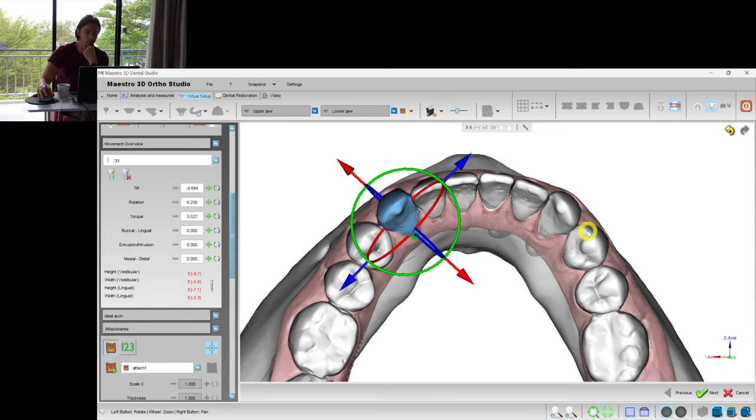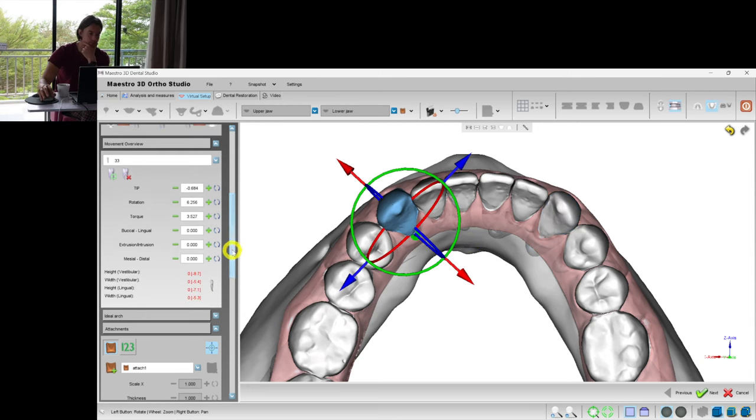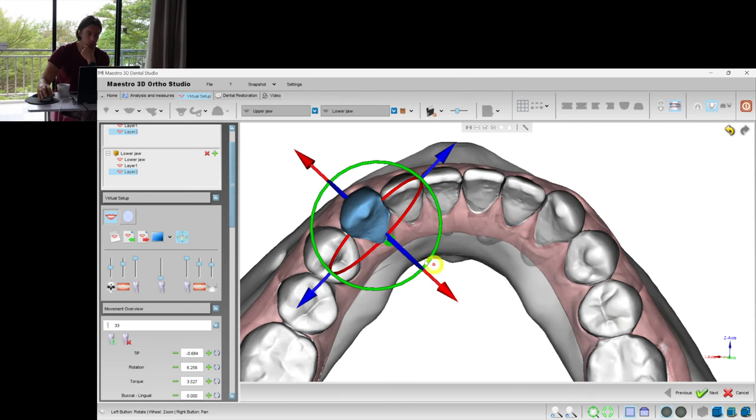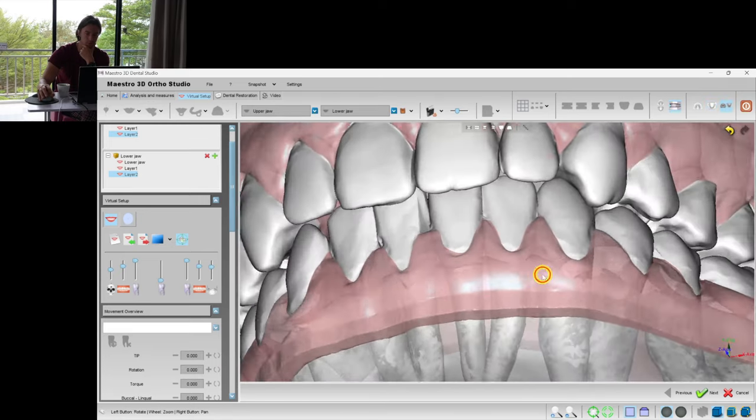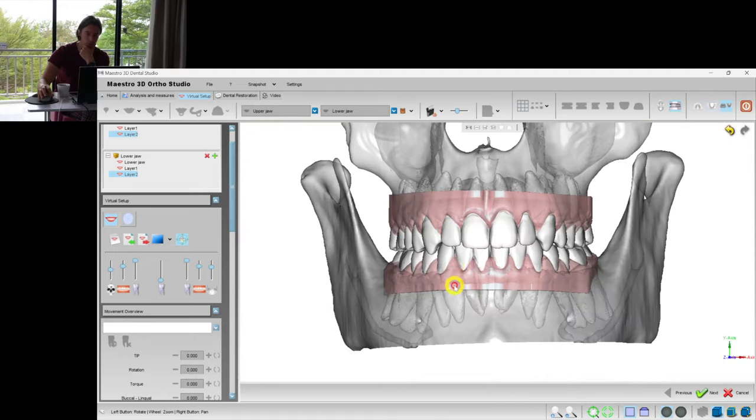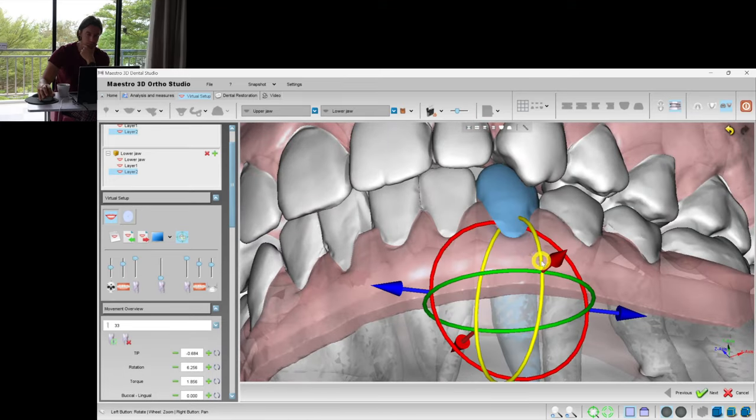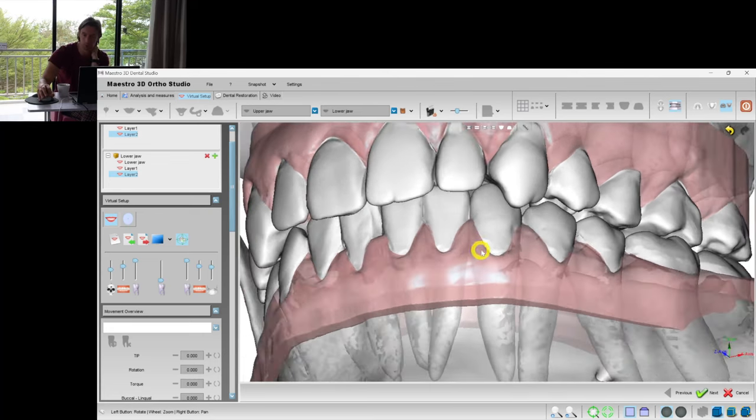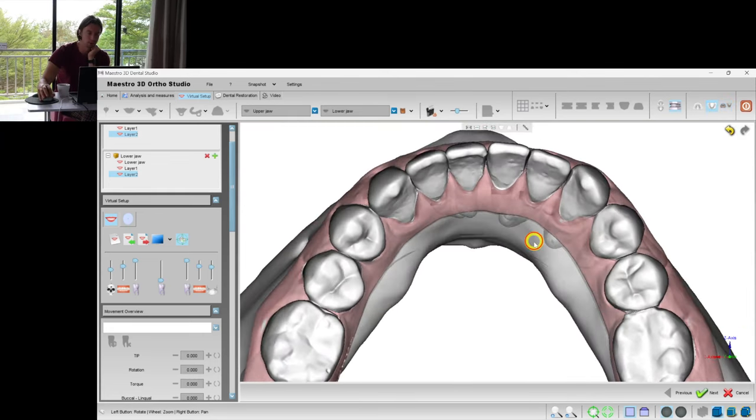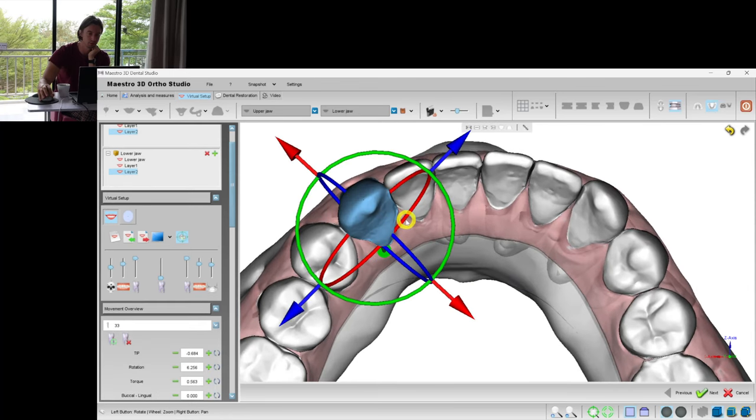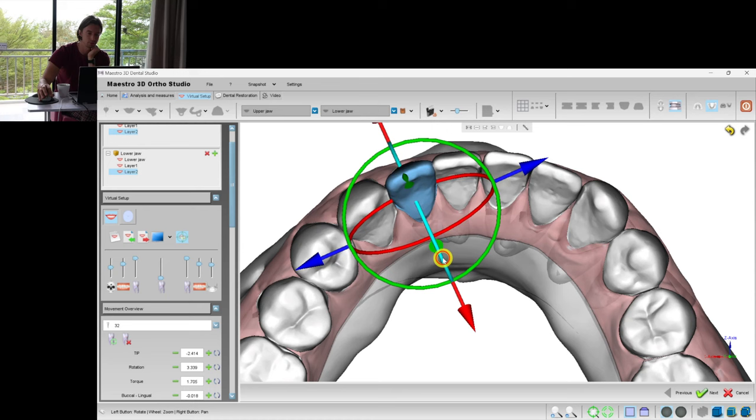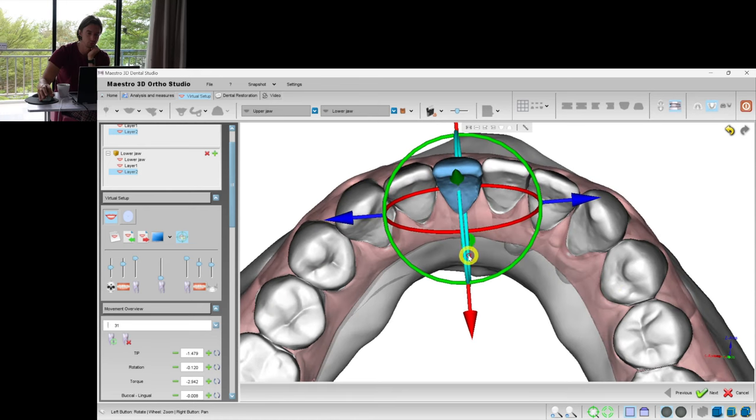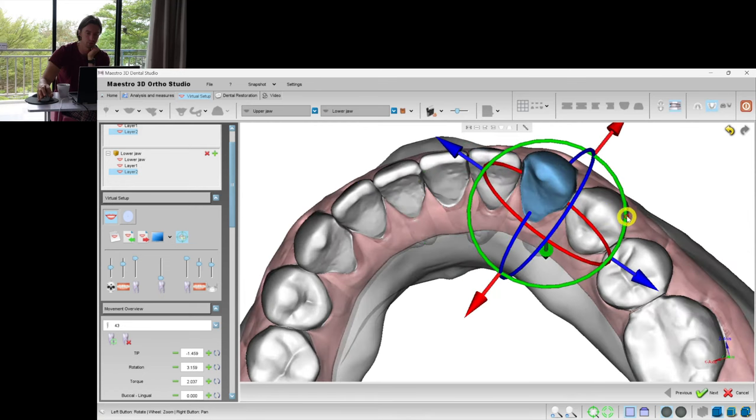We should not reduce the width between the canines. I would consider grinding these incisal edges as well. Now I think we are done with this collision, but now we can see that the canine is placed more lingually. Let's try to improve this by moving the other teeth.